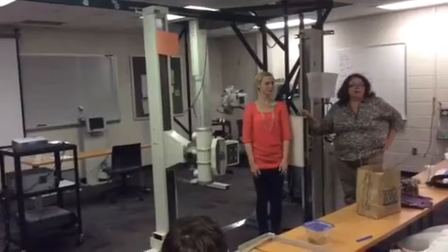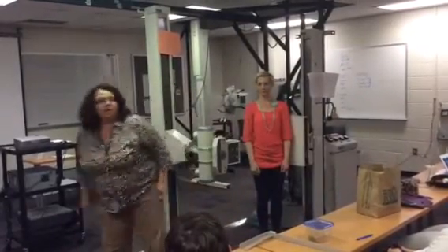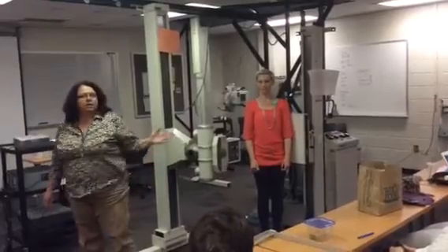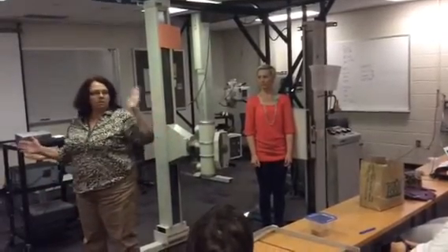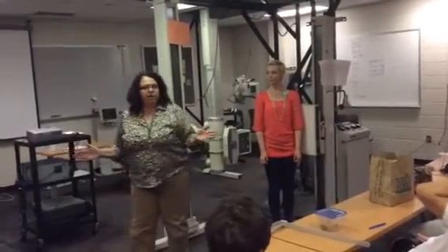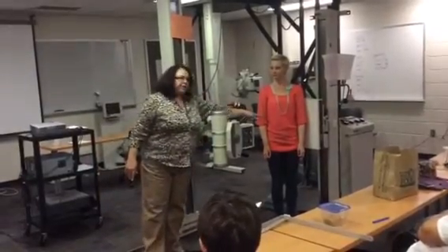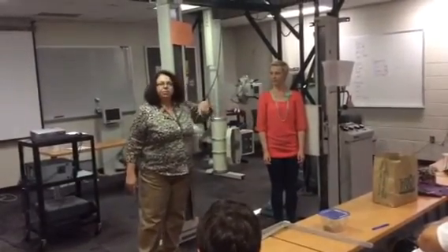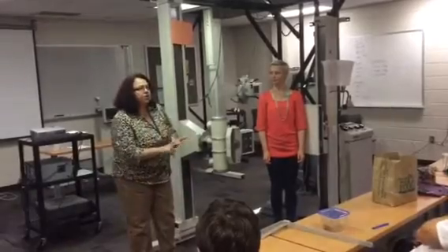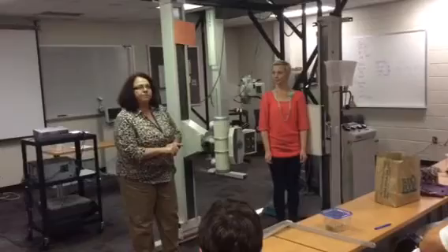Okay, now which parts am I going to see in this position? Right. You're going to see the side that's close, because what you're trying to do is turn that part so that it's parallel to the film. So that one would be parallel. That's the one you're going to look at, the one that's closest. Posterior oblique lumbars, you see the side that's closest to the film. Okay?